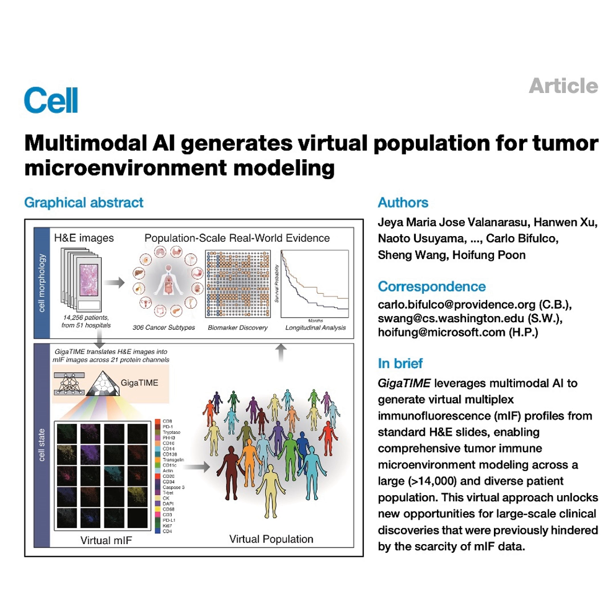We started with the old workhorse, immunohistochemistry, IHC. Right, and think of IHC as just a single static snapshot. It uses a stain to light up one specific protein. Just one per tissue slice. So if you want to understand this complex ecosystem with dozens of players, a single snapshot is just completely insufficient.